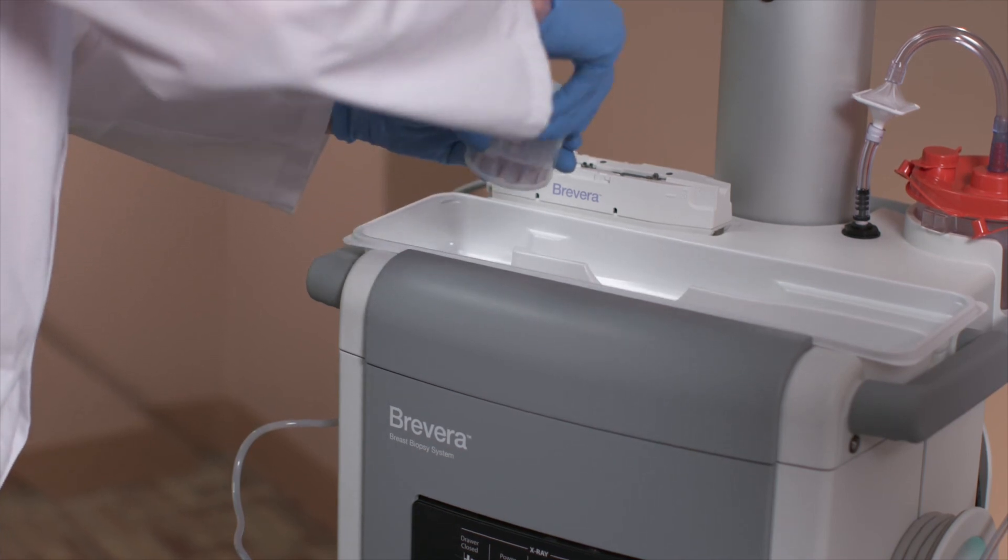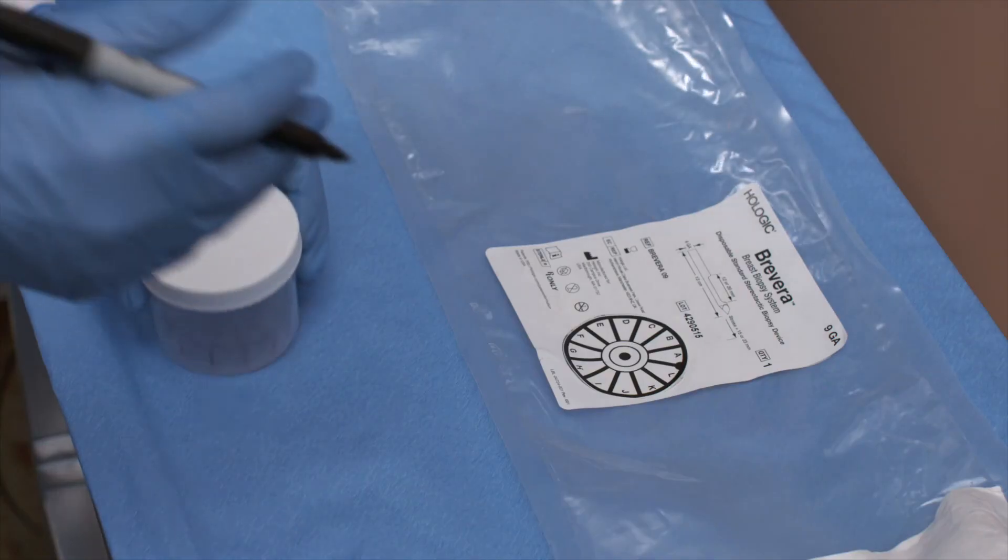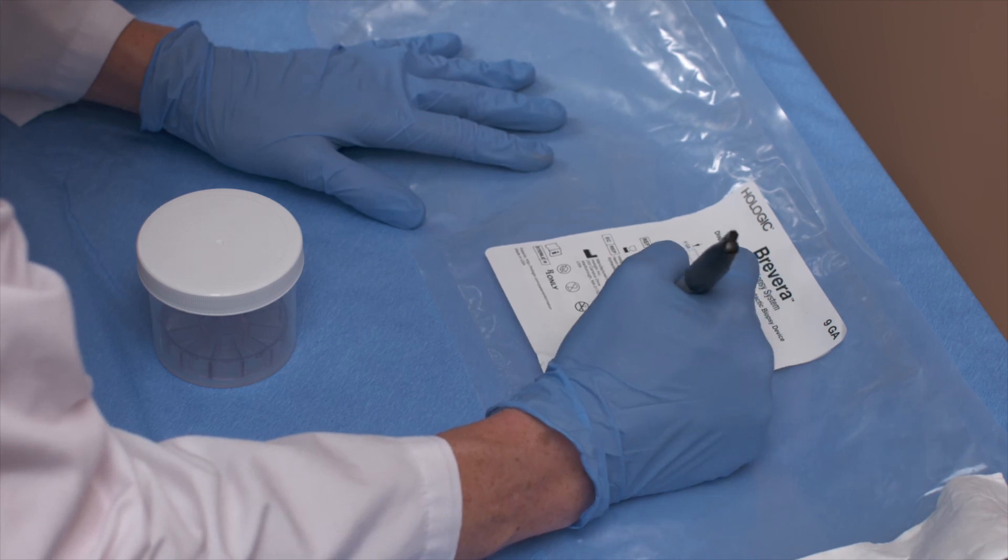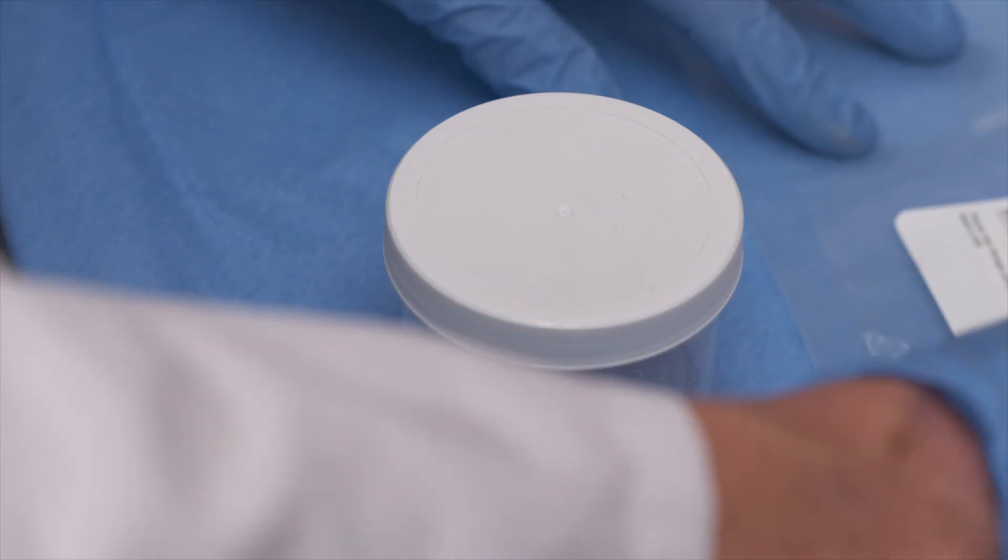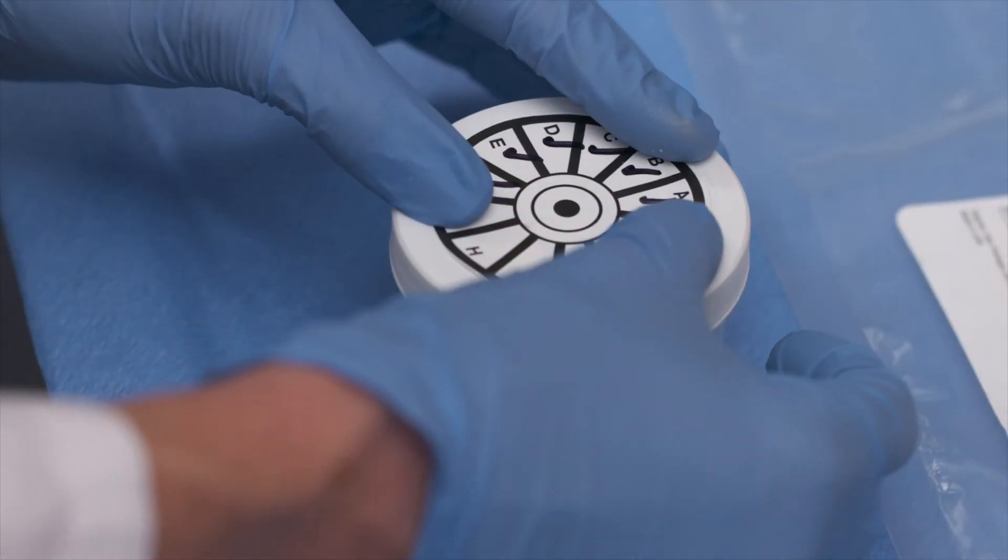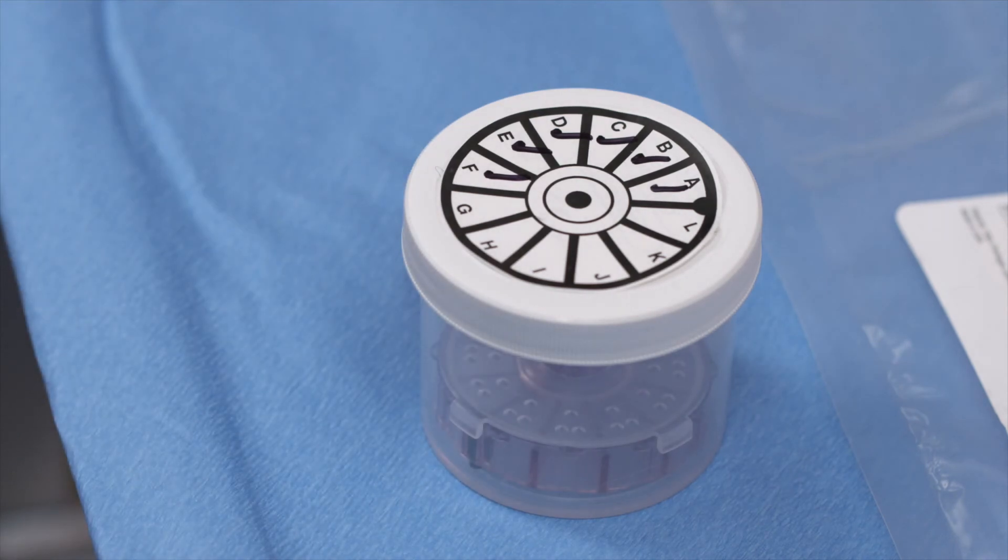The technologist may use the sticker from the Brevera packaging to check off which chambers contain specimens of interest or calcifications. The technologist will prepare the samples for pathology, per hospital policy.